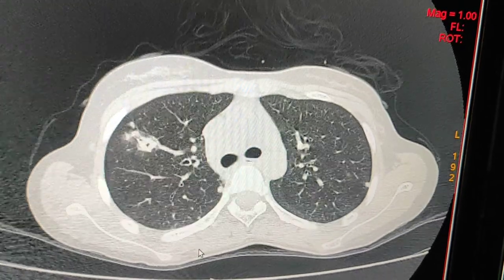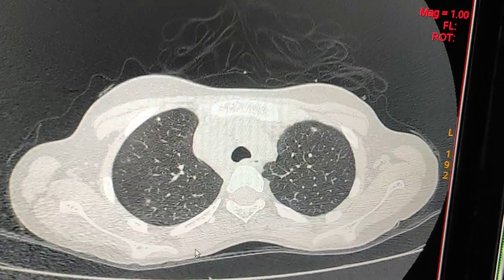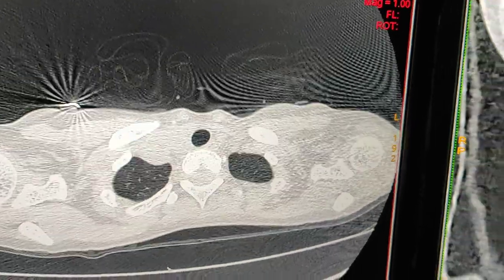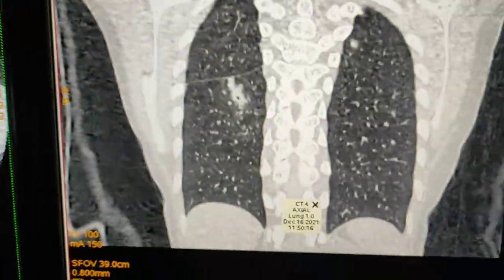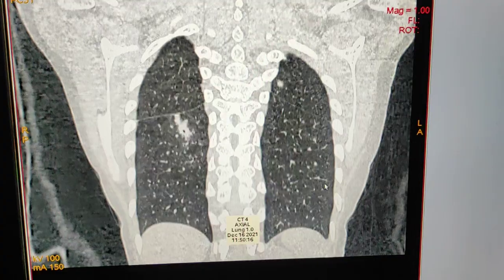This is the axial reconstruction. Now I will show you the coronal reconstruction — this is the coronal reconstruction.